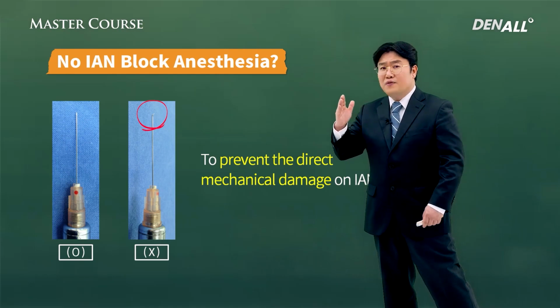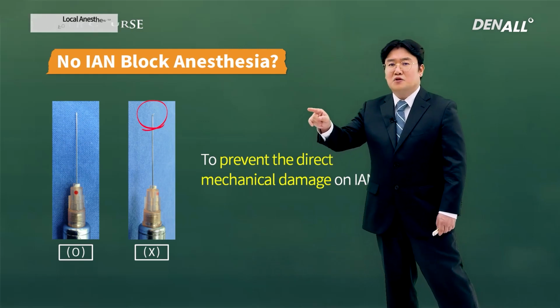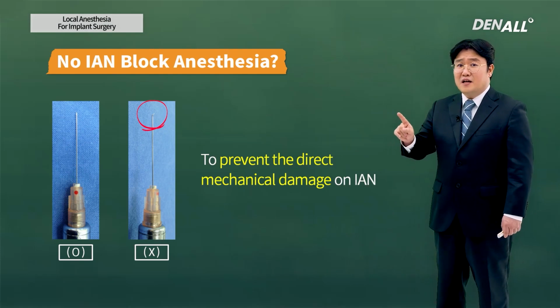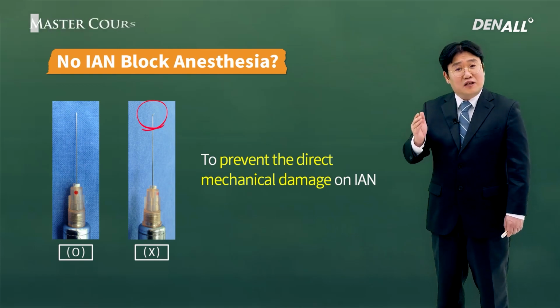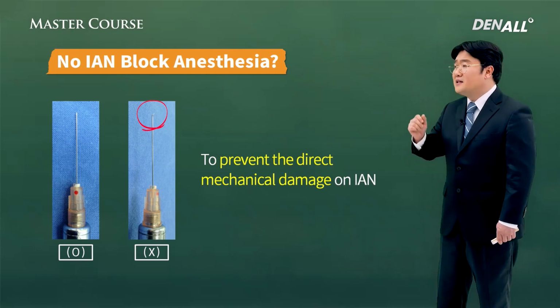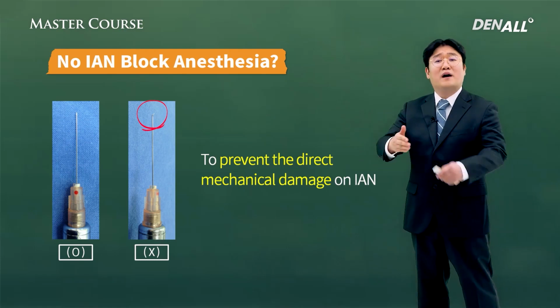If this type of needle directly touches the inferior alveolar nerve, it will be injured for certain. Therefore, here's my first suggestion to you. For all block anesthesia, including the inferior alveolar nerve block, a clean needle should be used. You'd better not use a needle deformed or bent as it touched the periosteum.